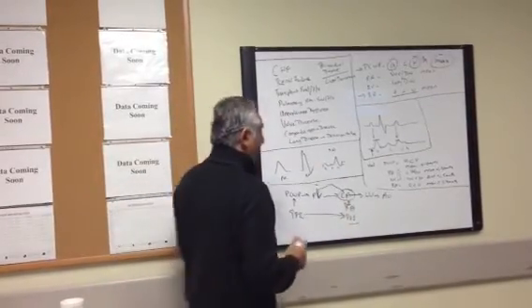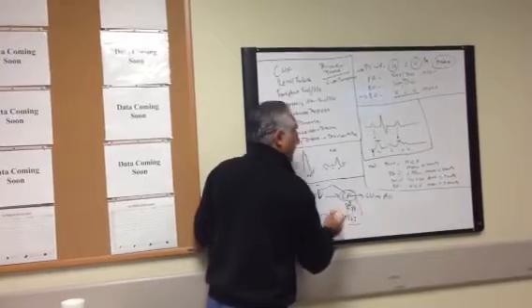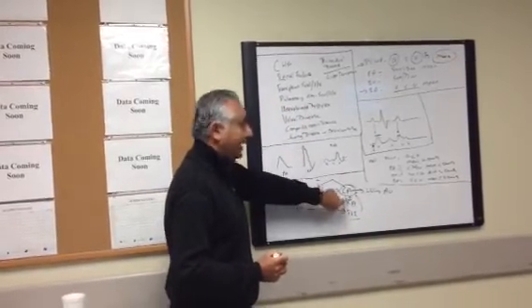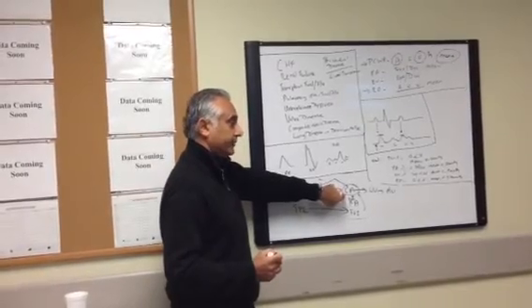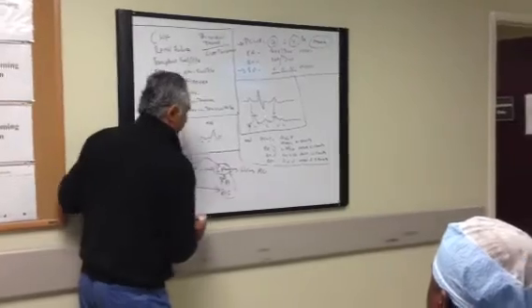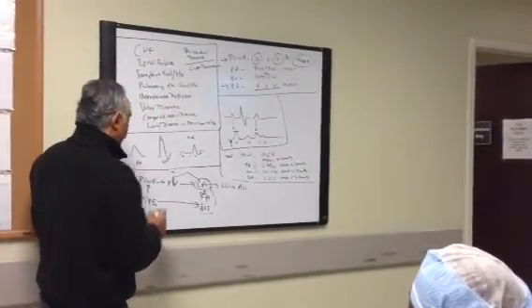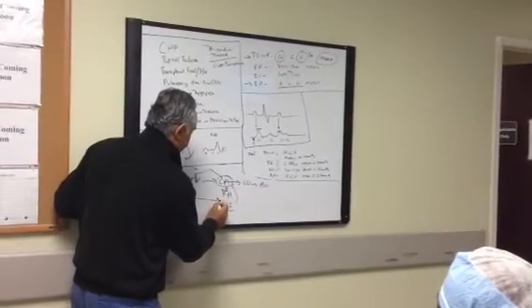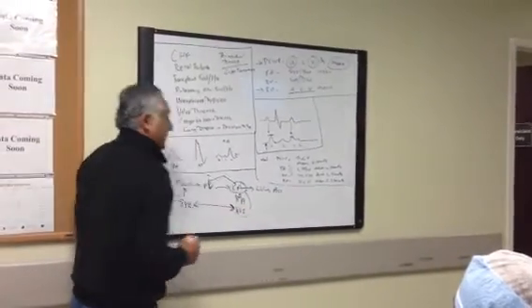Well, that gradient can only occur if there is mixing of blood from the right atrium into the left atrium. That there is a right to left shunt coexisting. Okay? Because if I measured it, I would say, oh, my left atrial sat is 88. That's kind of low. So yes, it is important to get a pulmonary capillary wedge pressure, wedge sat, because it allows you to see this.